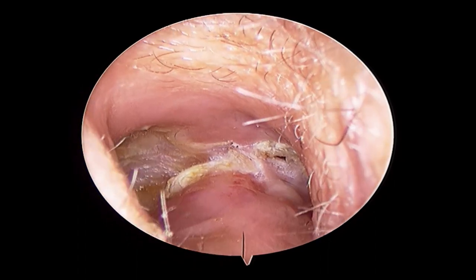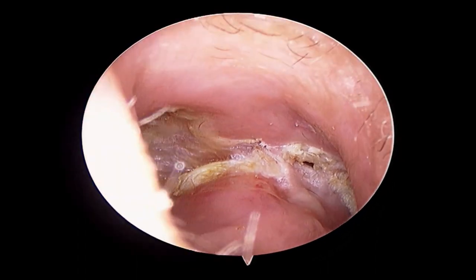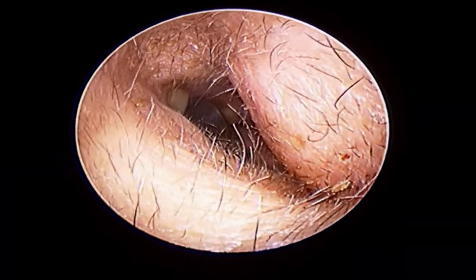You can also see the bed of the mastoid cavity, and there might be some debris which he will also remove.